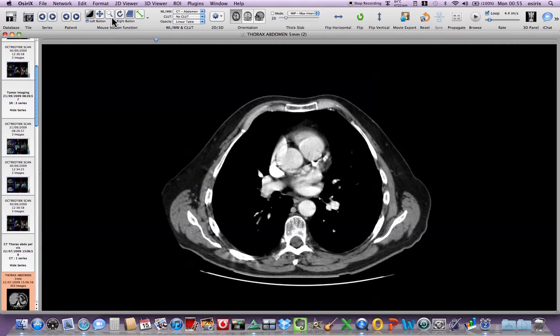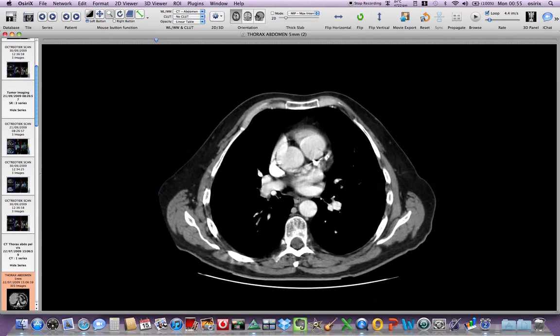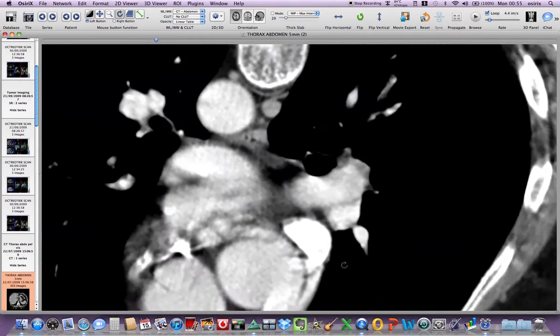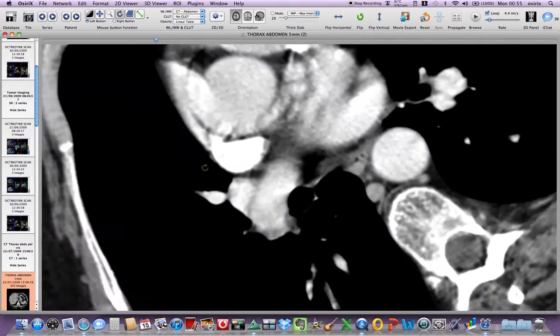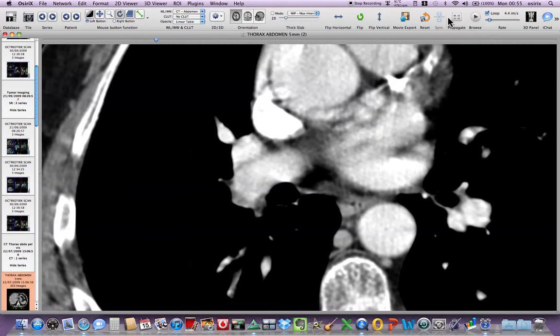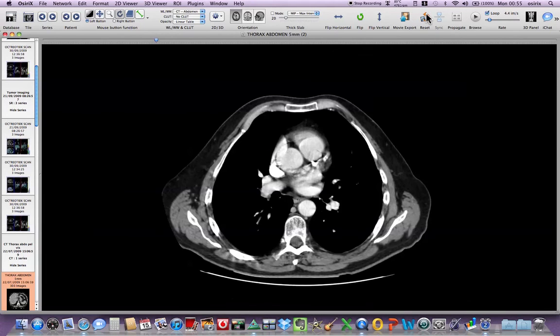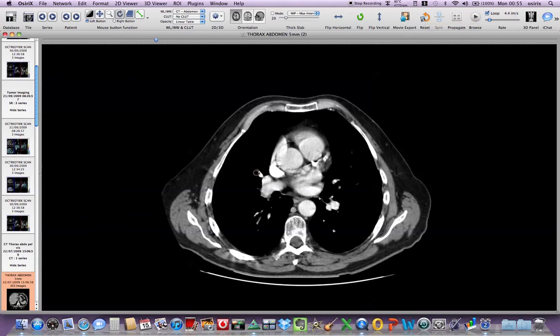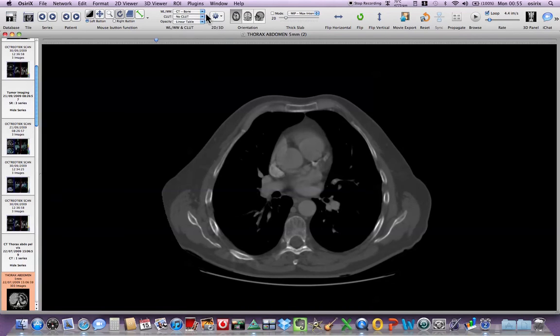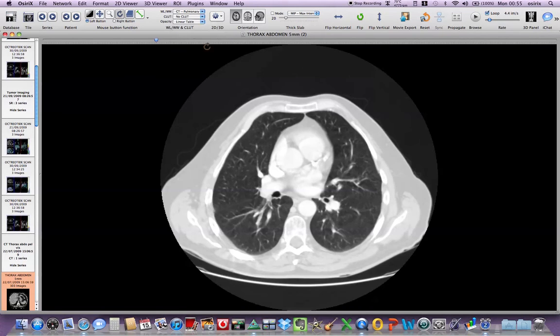We can zoom up the image. We can then, if we wish, rotate the image. But I tend not to use that button and you can always reset it back to the normal default settings. If I wish to look at this on lung windows I use the drop down menu in the level and width bar and I can put it on bone windows, lung windows etc.